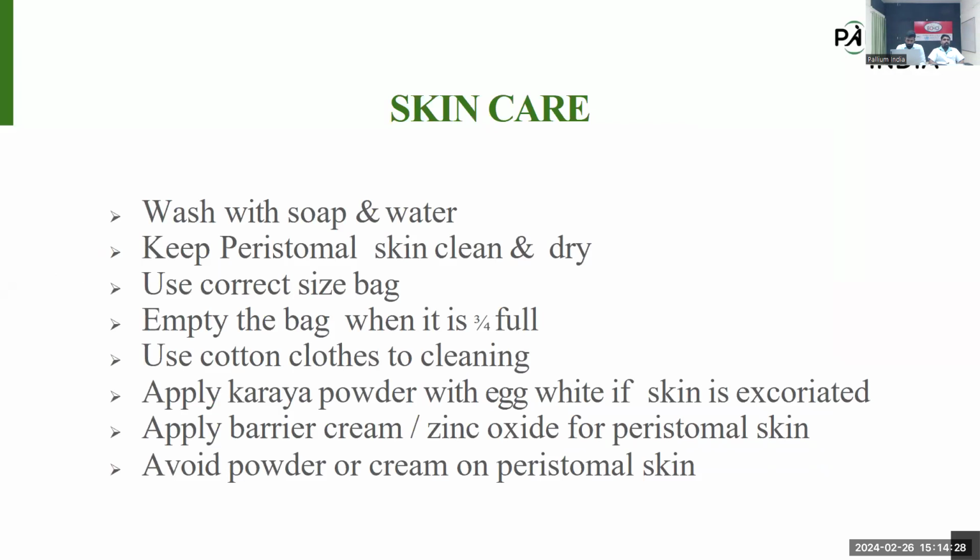We need to prevent the skin excoriation. That's the important thing. For that, we can do proper skin care. Wash the stomal region and the peristomal region with soap and water. After washing, we need to keep the area very clean and very dry. After drying, we can fix the bag.